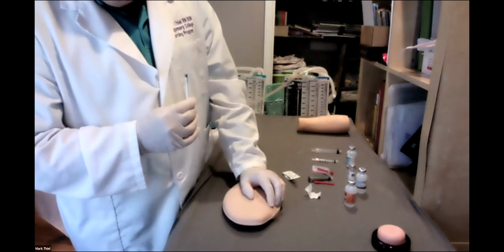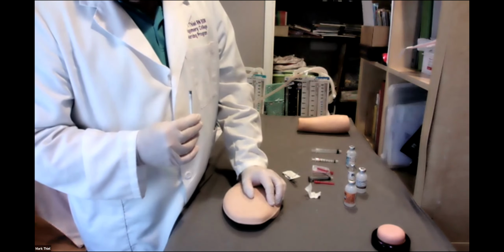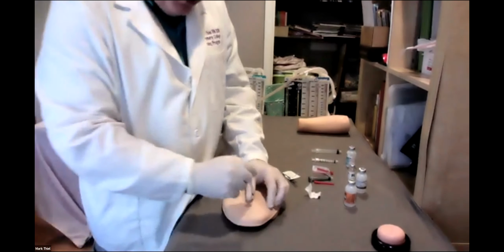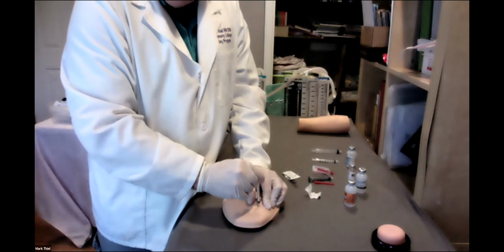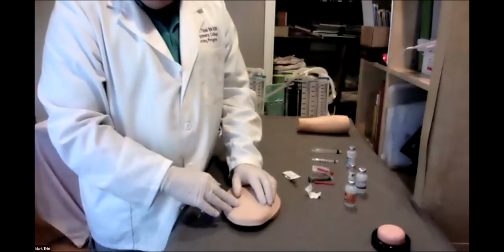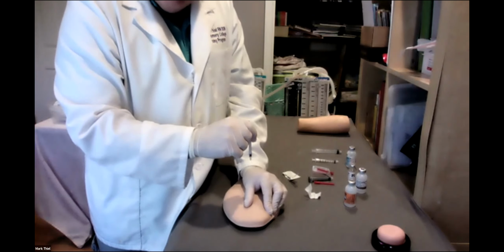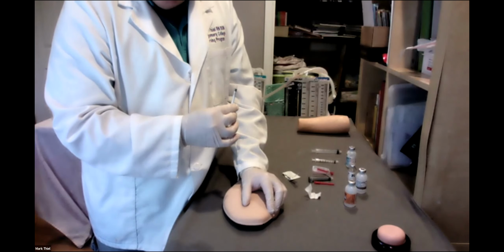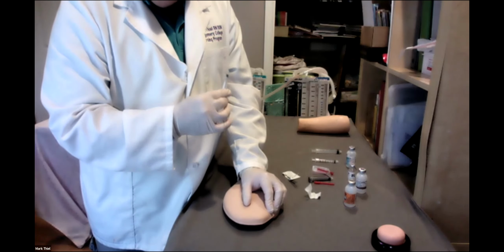Now, you may see and you may hear it is not on the rubric, but evidence-based practice is that once you inject, you hold the count of 5. Rationale: to allow for the medication to disseminate into the sub-Q before withdrawing the needle. Talk to your professors about this, please, with the injection procedure. Like I said, this is not included on your rubric.